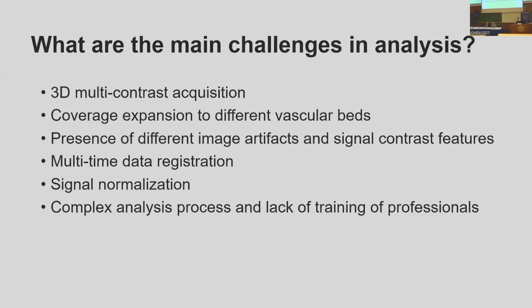The other thing you also heard today from Dr. Narula's talk, in looking at peripheral arteries, carotids, and coronary arteries, is that for every single artery the so-called atherosclerotic lesion composition may actually be very different. When you simply refer to this as a stenosis, I think you're really missing a lot of information. Once you start looking at the others, their signal features may be very different depending on which blood vessel territory you're looking at.